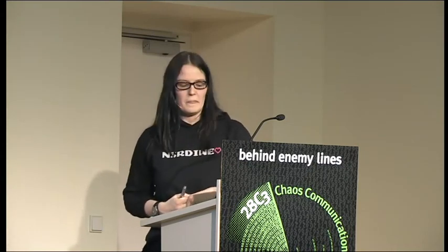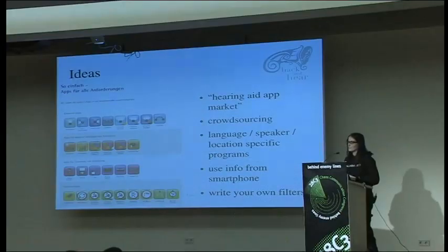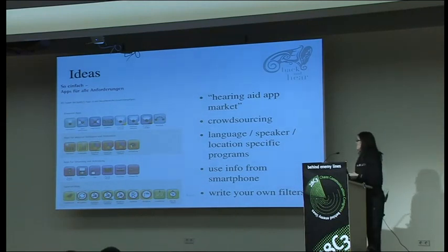And regarding the hardware, it would be nice if there were some open standards. It would be cool if you could print your own hearing aids with a 3D printer, at least the part that goes into your ear, so that it fits really well. There are a lot of possibilities, but the market is really, really slow, and they are still trying to figure out how to connect Bluetooth. For me, it's just way too slow. I'd like to see more progress.